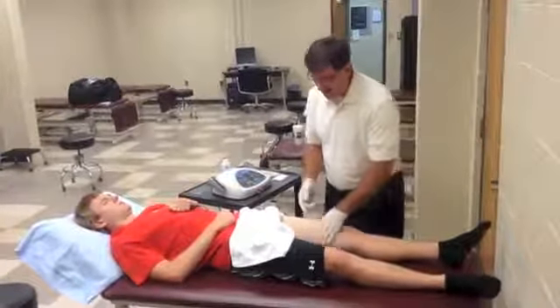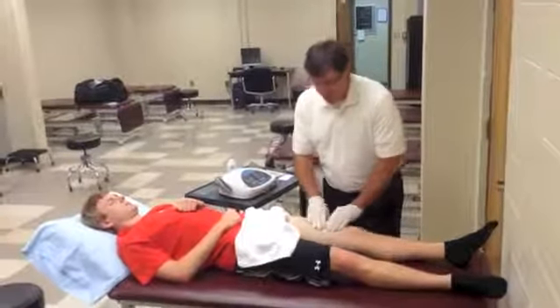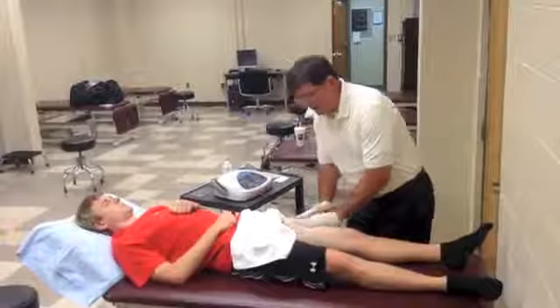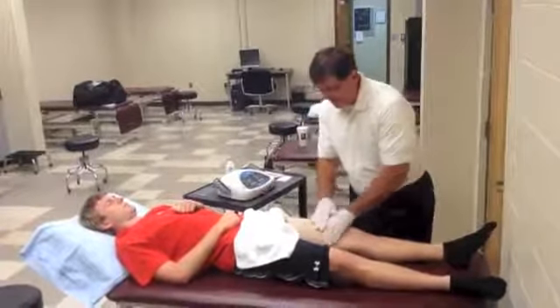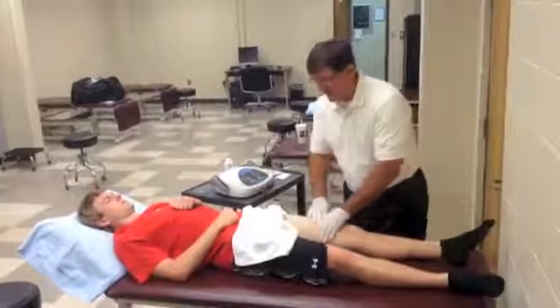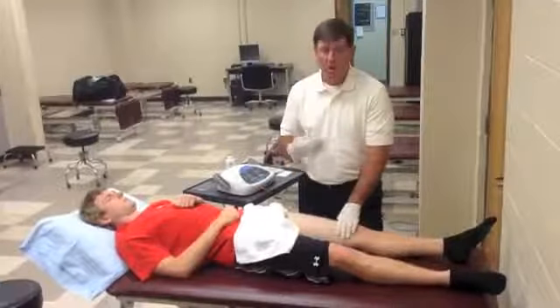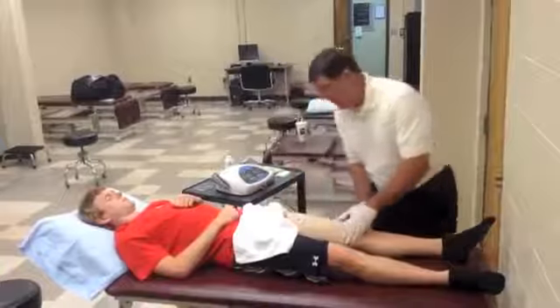Now, I've used a powder as a medium so that I can move smoothly and absorb any moisture, and as I said, I'm wearing these non-conductive gloves. This allows me then to do whatever amount of pressure or direction of pressure that I think is appropriate. Now, since this one is subacute, we're using a mid-range of frequencies. If the patient were acute, we would probably want to use a very high frequency, and if he's more chronic, we would use a more low and thumping type of delivery of the energy.